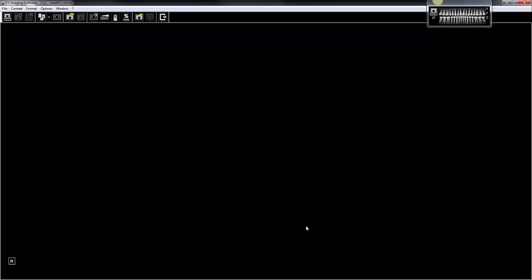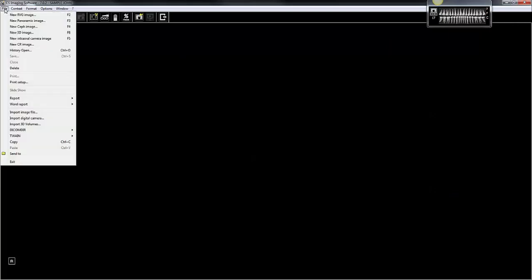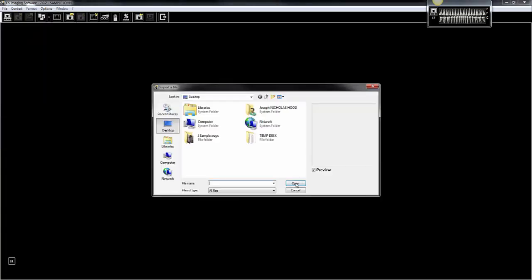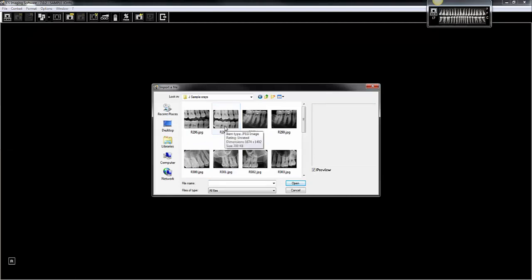Next, open the imaging software for that patient — this is John Sample — and go to File, then Import Image File, and browse to that folder. Here's a tip: you can select them all at the same time and import them at once.